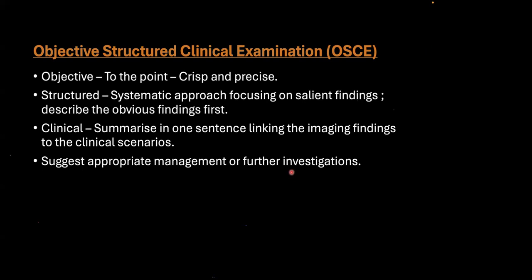It should be structured, a systematic approach which focuses only on the salient features. It is good practice to always describe the obvious findings first. And clinical means we have to correlate it clinically. We have to summarize it in one sentence, linking the images to the clinical scenarios.